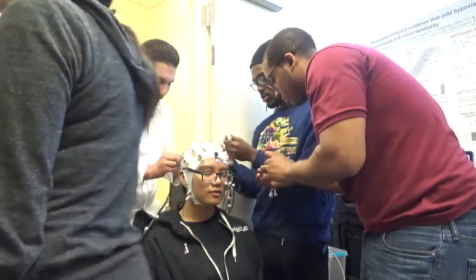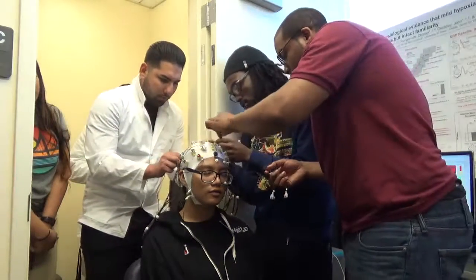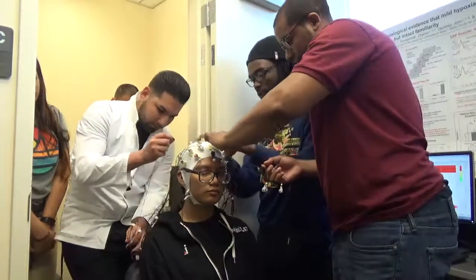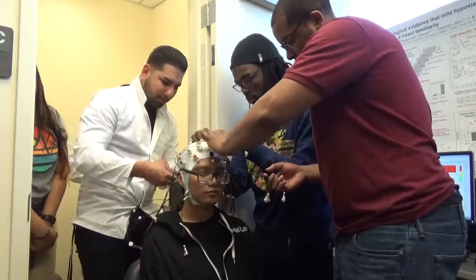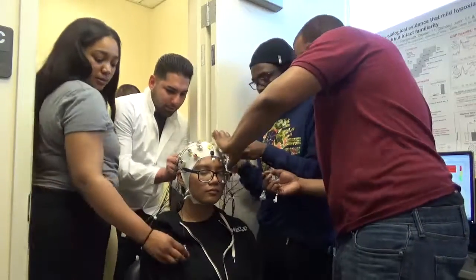Okay. You know what's good to do too? Put them all in a certain direction. So you can face them to the back because she's gonna be facing that way. Yeah, that kind of idea.